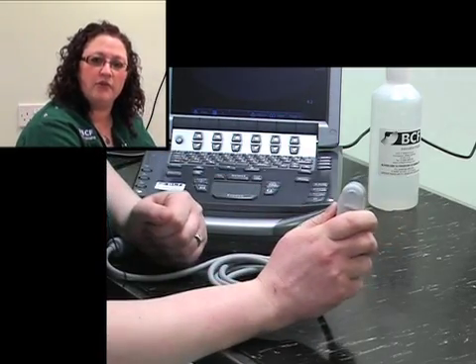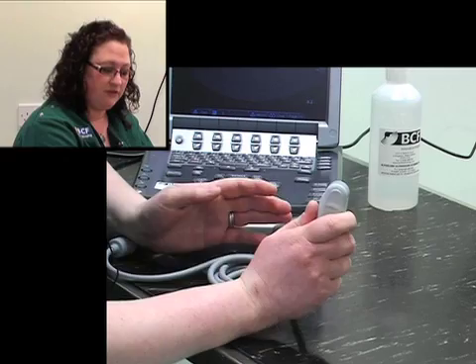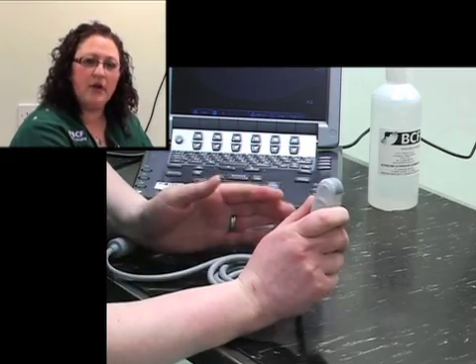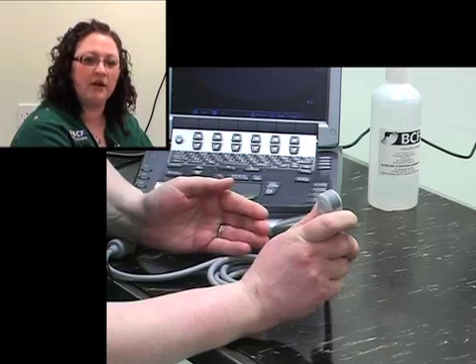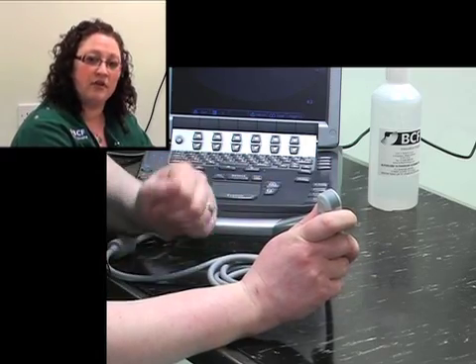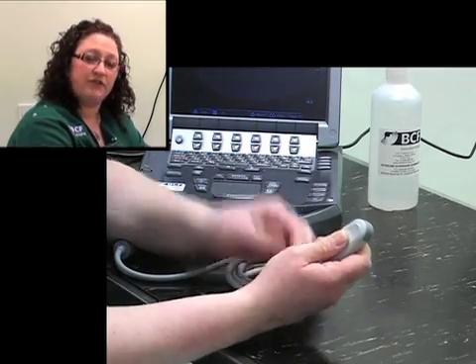Now we'll go on to some of the movements that you can perform while doing an ultrasound examination. This will help to examine every organ in a very thorough and methodical manner, to know that you're absolutely seeing everything that you should. There are five movements. The first is rocking.